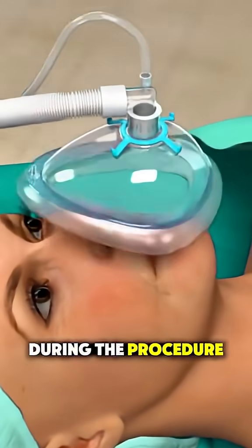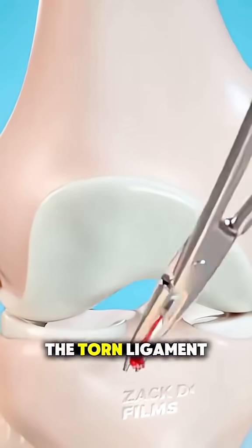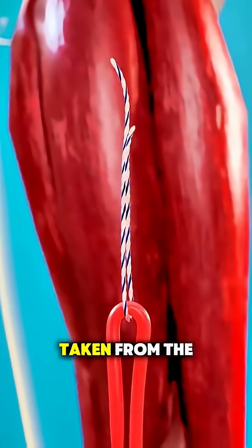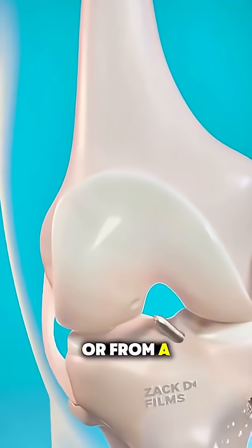During the procedure, the patient is put under general anesthesia. Instead of stitching the torn ligament back together, surgeons actually replace it with a graft — a piece of tendon taken from the patient's own body, like the hamstring or patellar tendon, or from a donor.